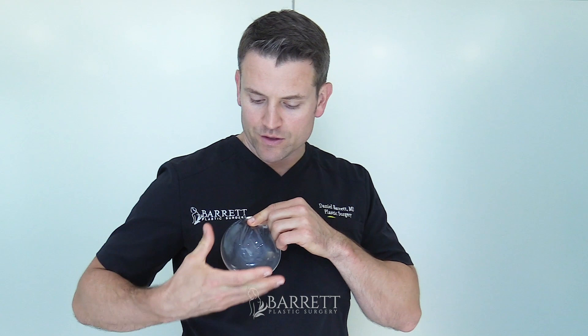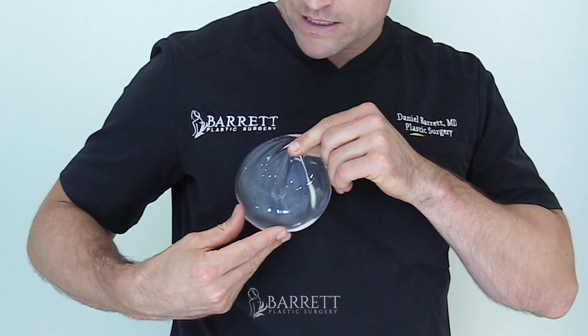So I want to show you what that looks like with the implant. When you're pinching the breast, you're not pinching the breast on the top — you're pinching the actual skin around the implant, so the implant moves up like that.